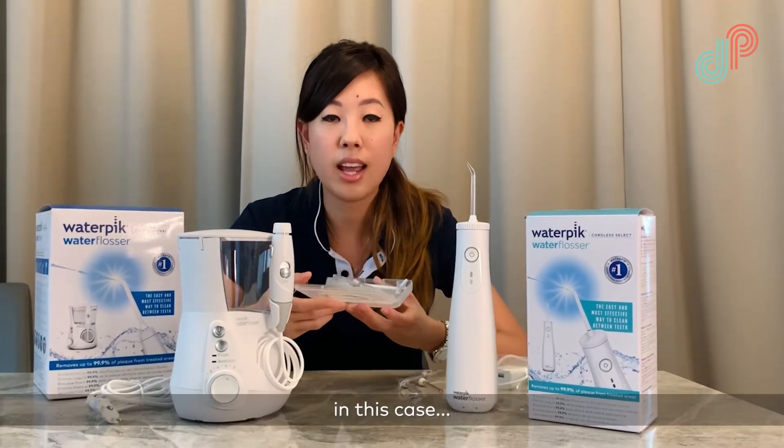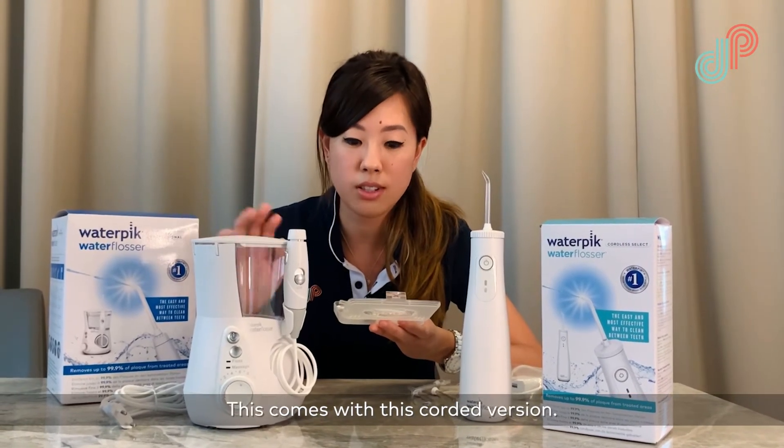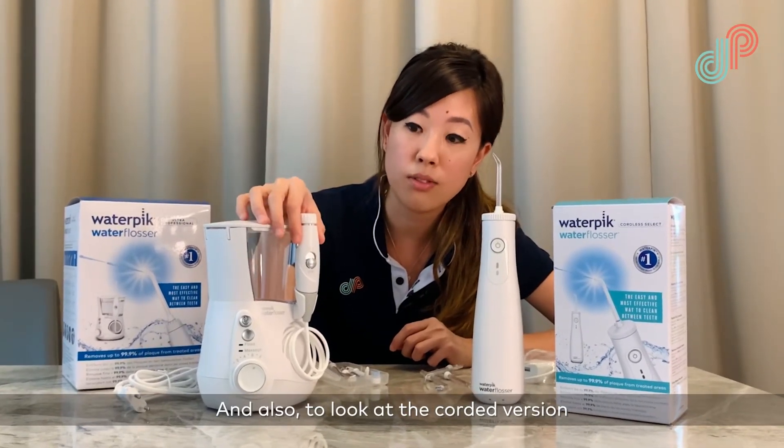In this case you can see there are seven tips, so this comes with the corded version. Again, very easy to snap in place.